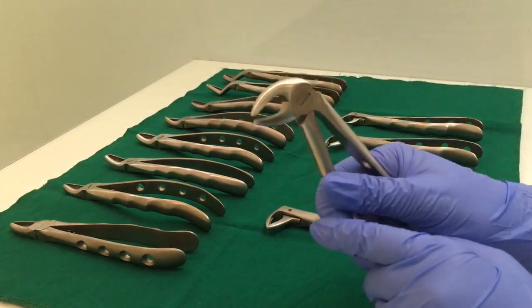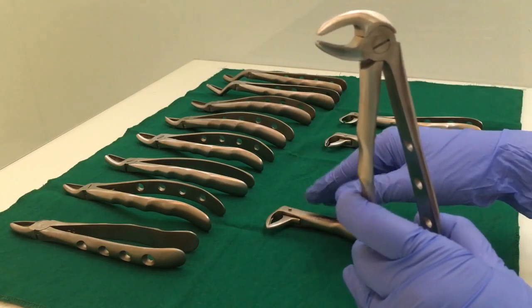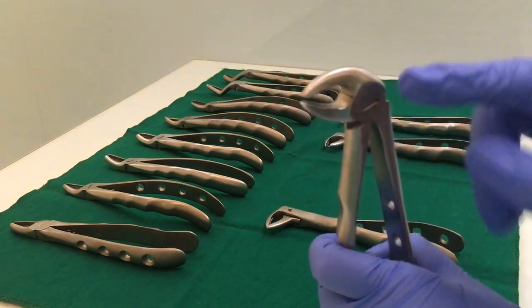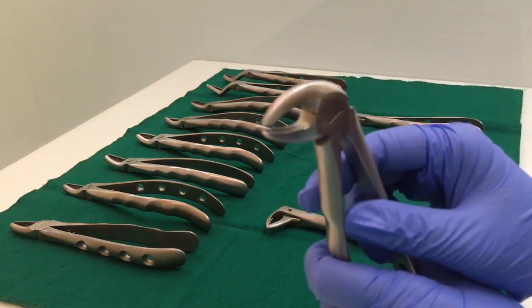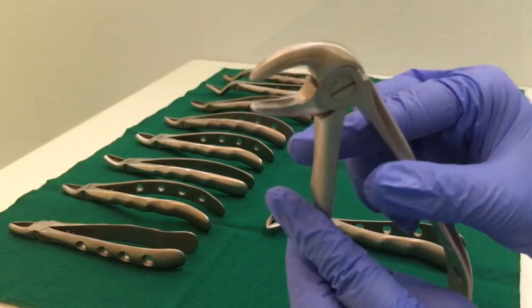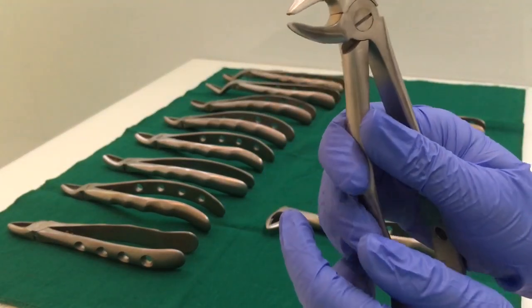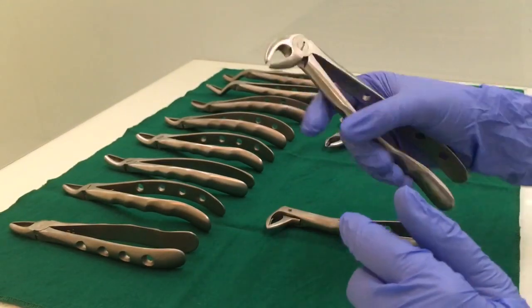The lower premolar forcep is similar to the lower anterior. The only difference is that the beaks are not meeting at the end — there is always a gap in between the two beaks. This is your lower premolar forceps.